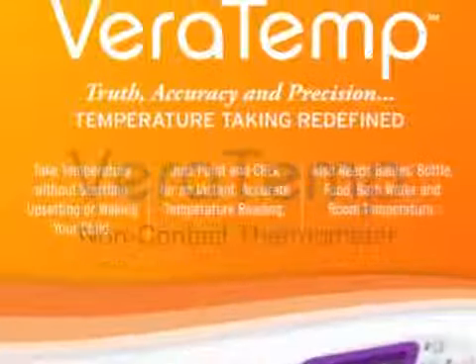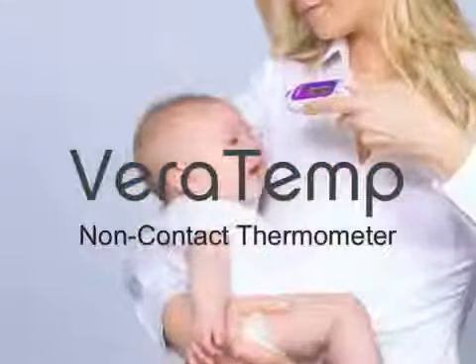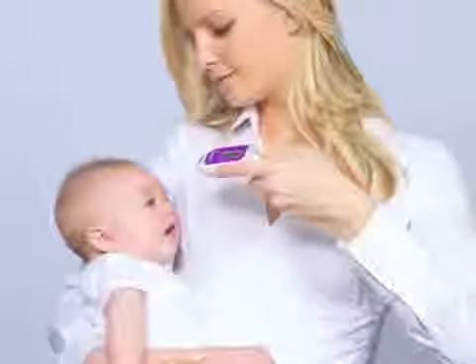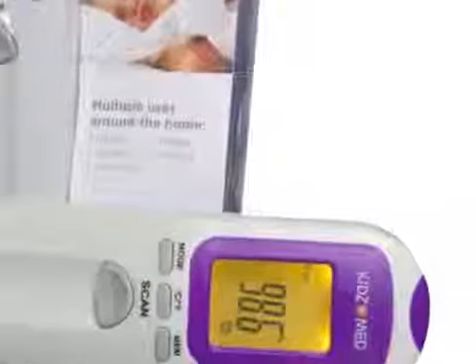The KidsMed Veritemp non-contact thermometer instantly measures body temperature without touching the patient's skin. This revolutionary technology offers instant, accurate readings of body temperature without the hassle of oral, rectal, or ear thermometers.